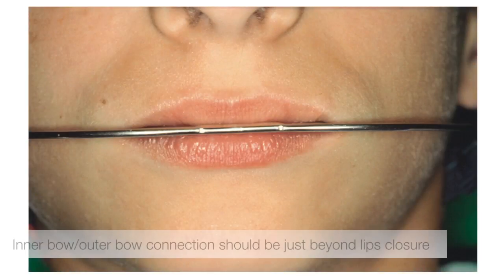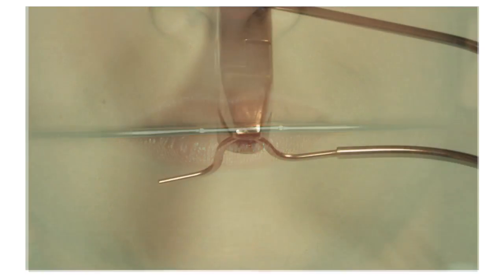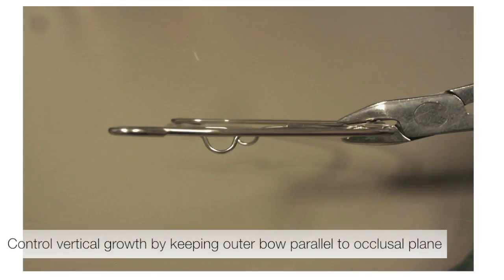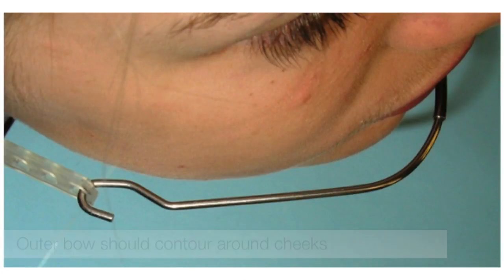The connection of the inner bow and outer bow should be positioned just beyond lip closure and balanced between the upper and lower lips. The position of this connection can be changed by expanding or constricting the adjustment loop. To control vertical growth, you want to keep the outer bow parallel to the occlusal plane. You adjust the outer bow to contour around the cheeks when the neck strap is attached.